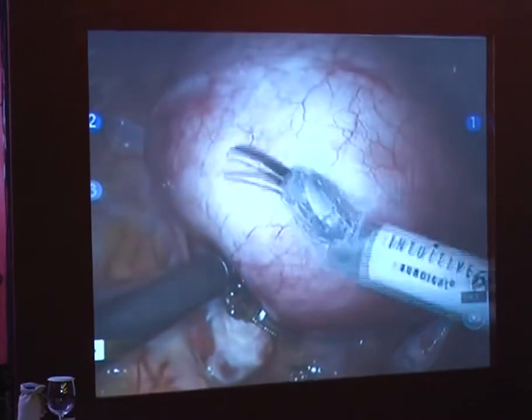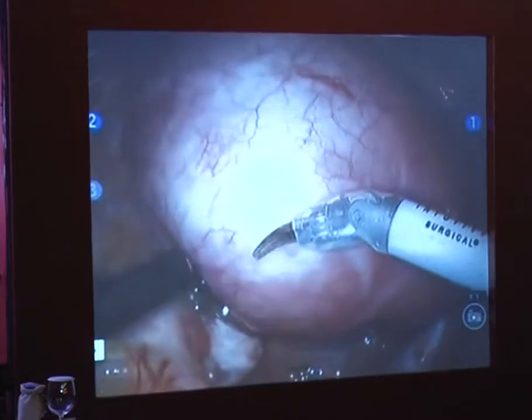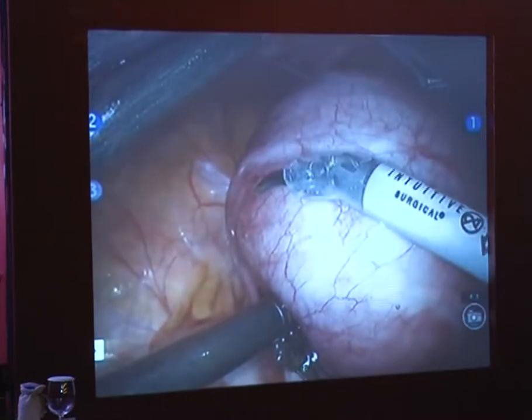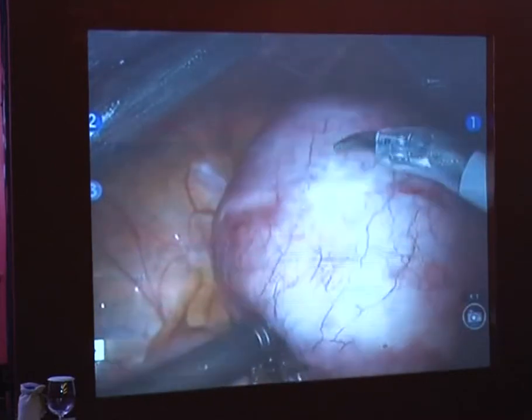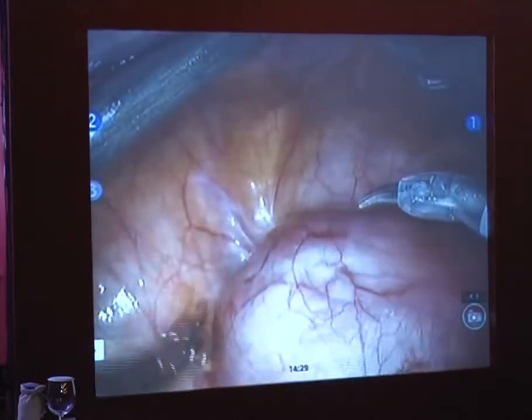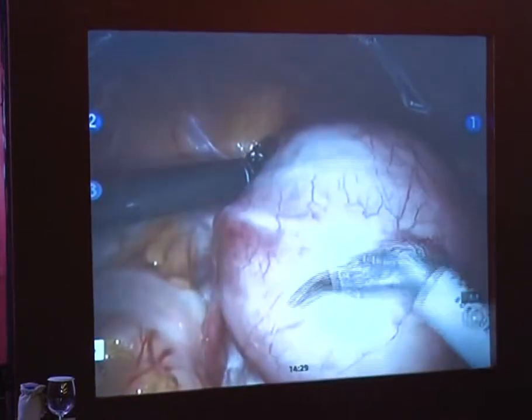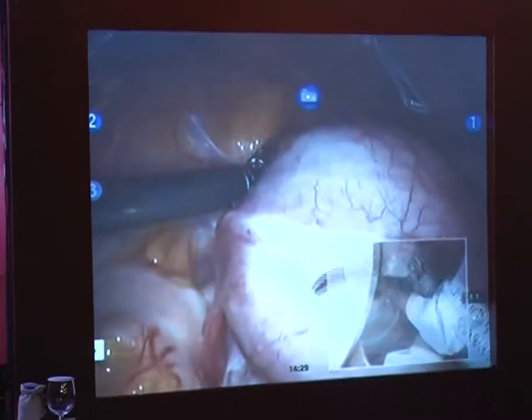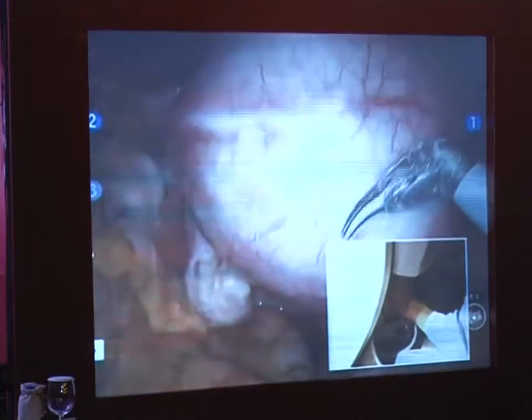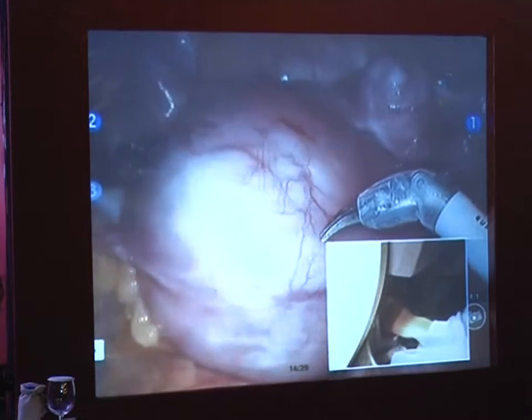You can see it's a pretty large myoma, makes up most of the fundus of the uterus, so I think we're going to have to go in this orientation here. That's another separate fibroid there. Go ahead and elevate the uterus again so I can just make sure. Normally I get an MRI on patients, but in this particular case I don't have the luxury of an MRI, so I just want to make sure I don't choose my incision poorly. So I'm trying to see what's going to allow me to sew this up the fastest. Okay, I think this will be good. Okay, go ahead and bring in the vasopressin, please.